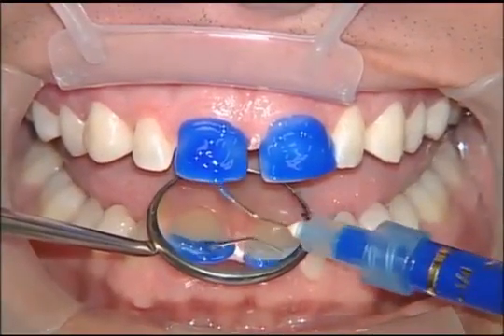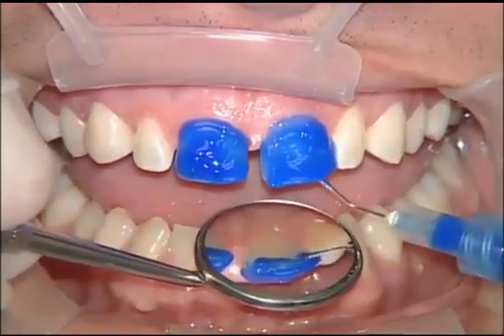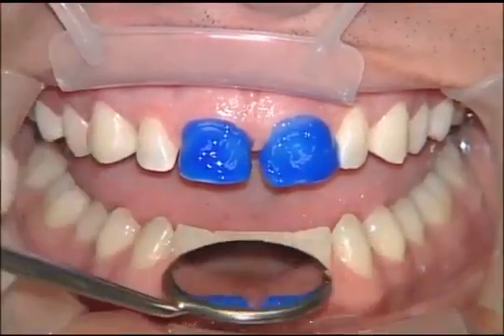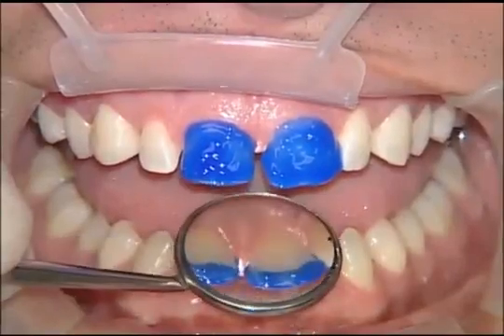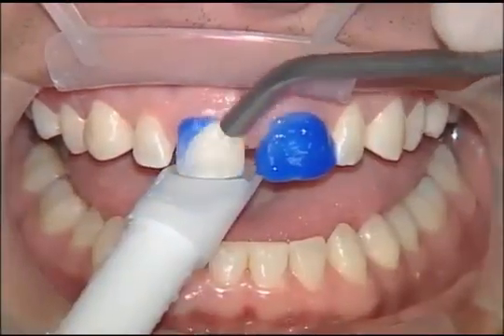Since these no-prep veneers will wrap onto the lingual surface because we are increasing the incisal edge length of all the teeth, we're going to go ahead and use a mirror just to verify that we have, in fact, got the etch onto the lingual third of the teeth. It's pretty easy sometimes to overlook that etch, but we do want to make sure we get a good bond everywhere. And we should, because we're bonding to enamel, the best bond in dentistry.